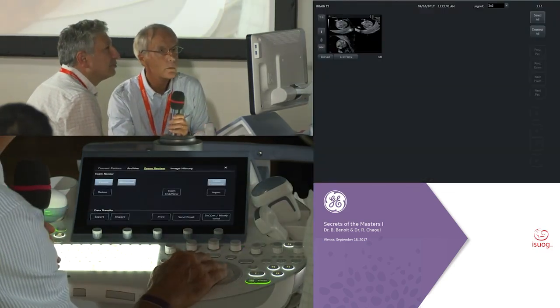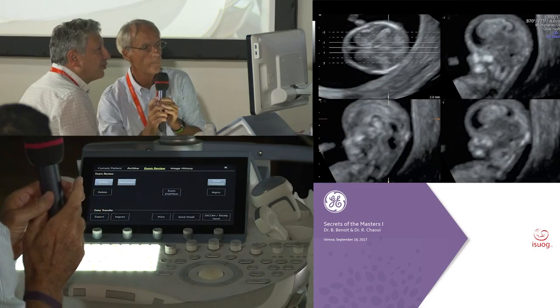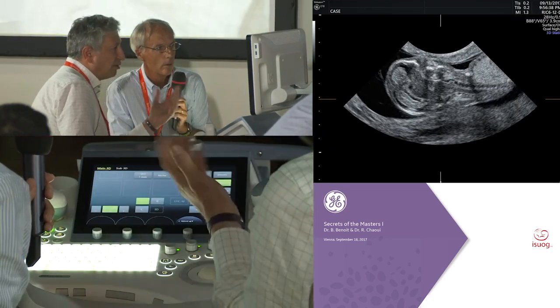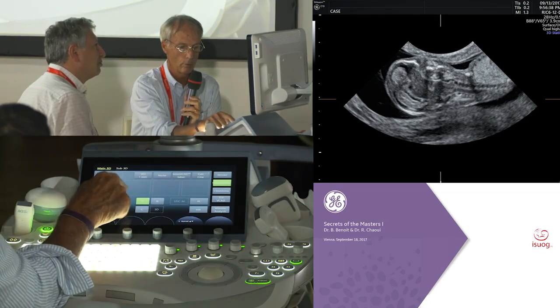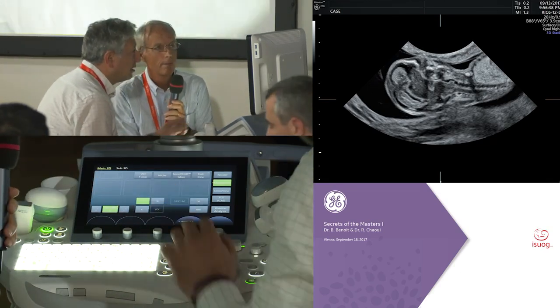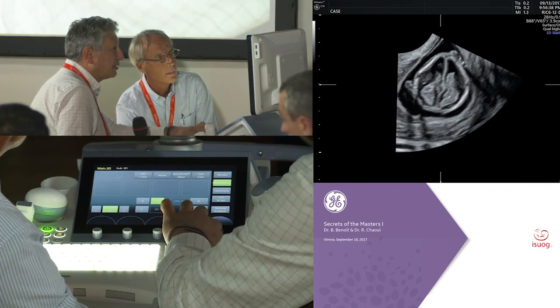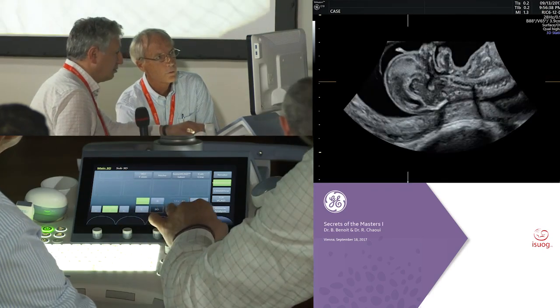Yes, we can take... Bernard wanted first that I show the brain on this case, and I said no, I want to have a normal one. So this is here, the volume acquired, not an optimal view. So I will do level 5. Okay, so you see well. And then again, I place the dot somewhere I recognize. So take this here. What is the B? Okay, this is good. I will rotate the view to have it. What is the gestation age here? It was 12 weeks.